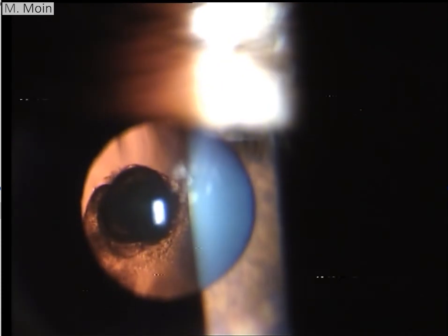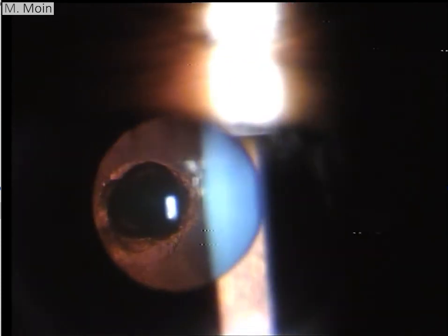Again see a posterior polar cataract on the other side with less amount of posterior subcapsular opacity and here you're seeing with a slit beam. I haven't shown you the very angled beam appearance but here you can see there's probably minimum degree of nucleus sclerosis NS1 plus in this patient.